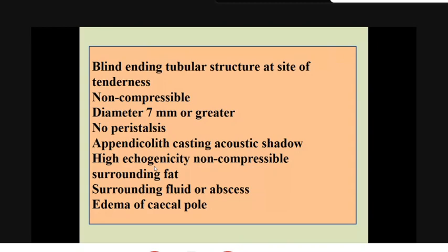We use the superficial probe اللي يسمونه linear probe which has a higher frequency, at least 7 megahertz. المفروض انه انا احتاج more higher frequency to diagnose acute appendicitis from 7 to 15 or 20 اعتمادا على الجهاز.